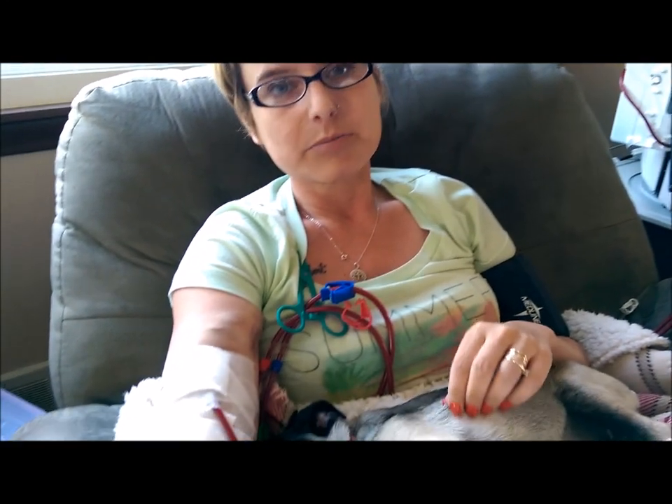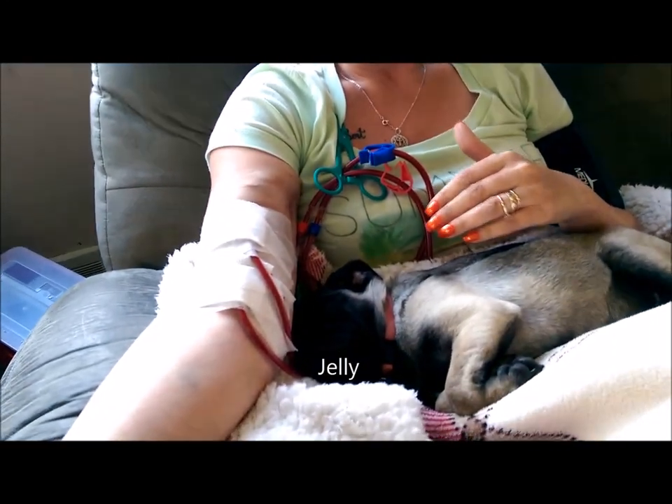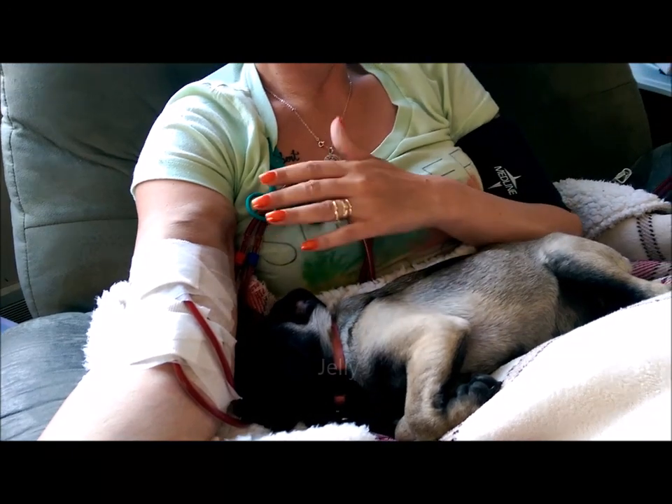When you first make the transition from training to home, the first couple of weeks are kind of hard. It's a big adjustment and it's scary being on your own, but it's worth it. It's so much better for me to do dialysis a little bit every day instead of being hooked up to a machine for three and a half to four hours every other day.